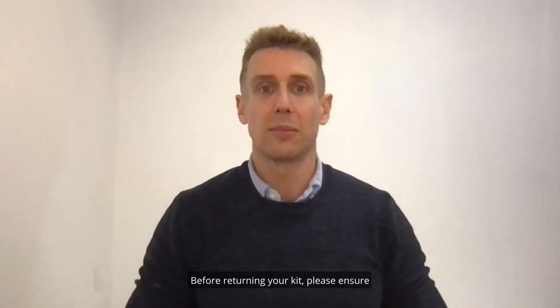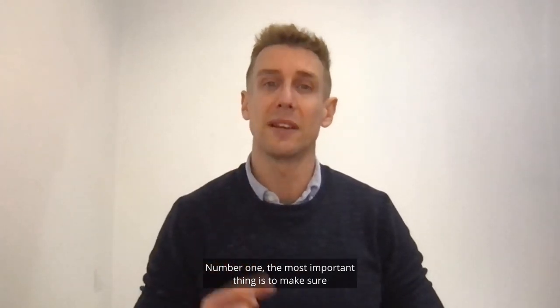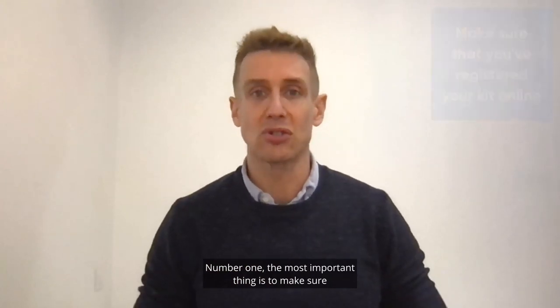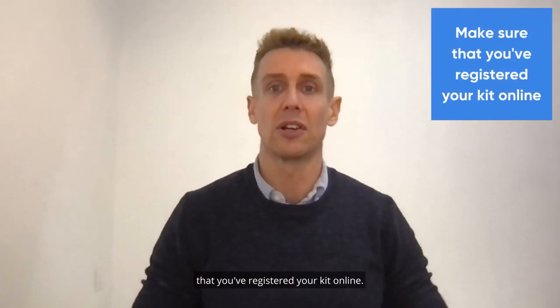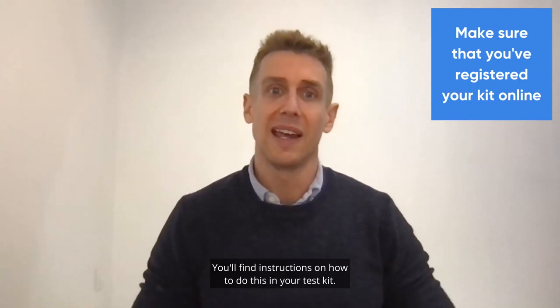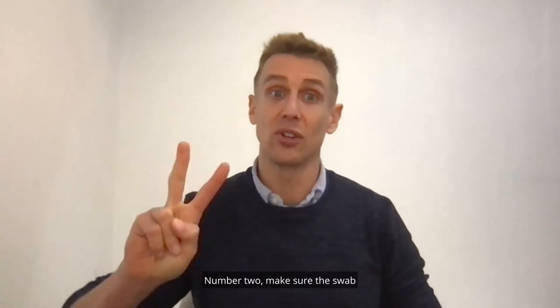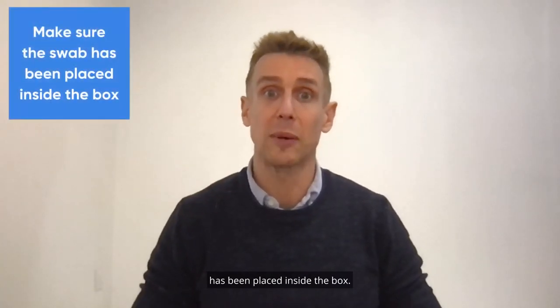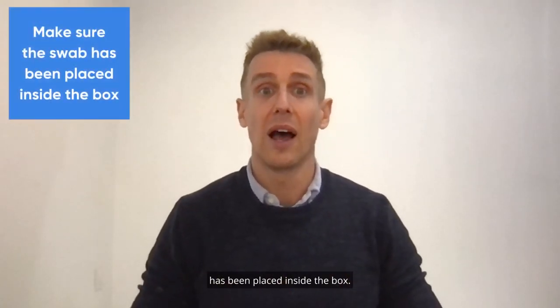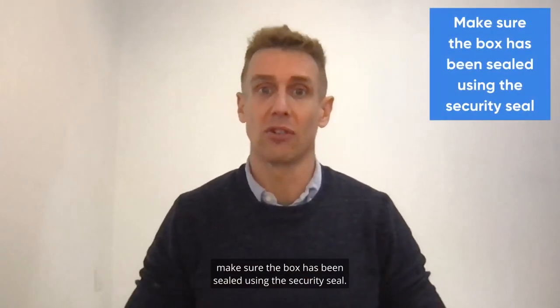Before returning your kit please ensure that you have done three things. Number one — the most important thing — make sure that you've registered your kit online. You'll find instructions on how to do this in your test kit. If you don't do this your test will be discarded. Number two, make sure the swab has been placed inside the box. And number three, make sure the box has been sealed using the security seal.